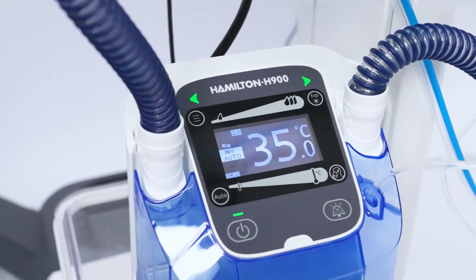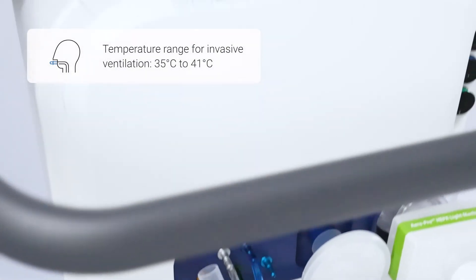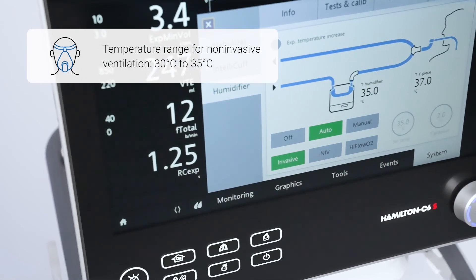Regarding the temperature settings, please note that for invasive ventilation, the temperature range on the humidifier is between 35 and 41 degrees Celsius, whereas for NIV, the range is between 30 and 35 degrees.